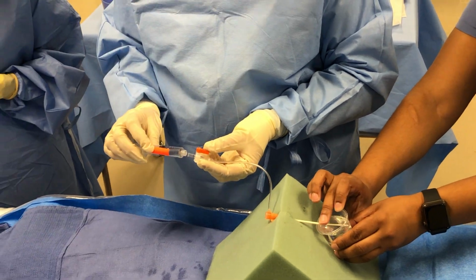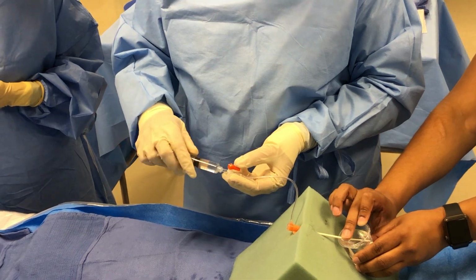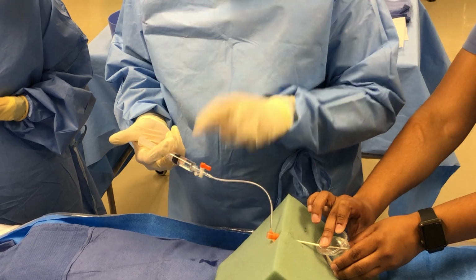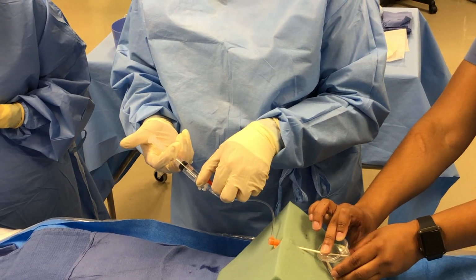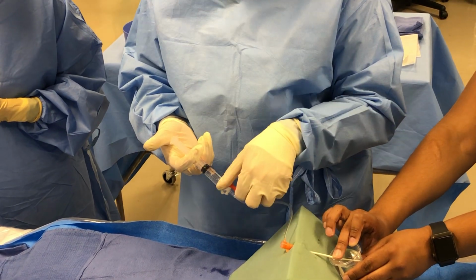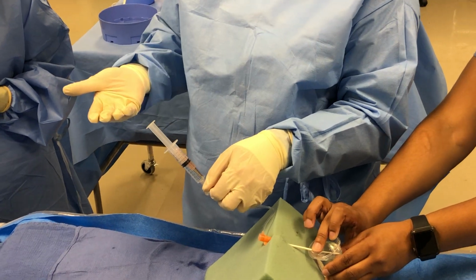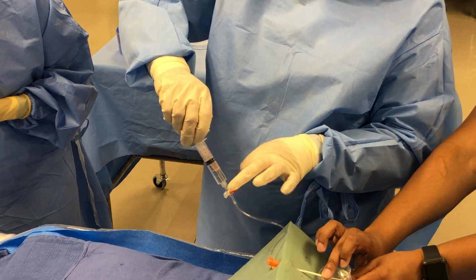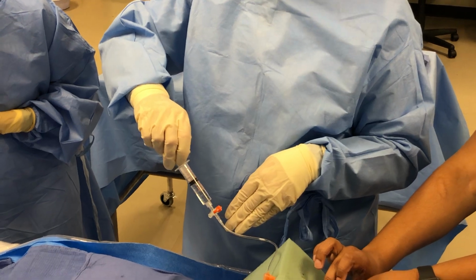All right, so when you're gonna flush, remember that's why we need some room here. Because every time we connect, there can be some residual air. Okay, a lot of docs are gonna go ahead and screw it on and then go ahead and flush a little out that side port. You're gonna open the stopcock just like you were gonna flush it, but instead of going forward, you're gonna draw back. Okay, we're gonna have the butt of the syringe up because air's gonna rise. So we're gonna come up, you saw that bubble? We should be getting blood return as well.